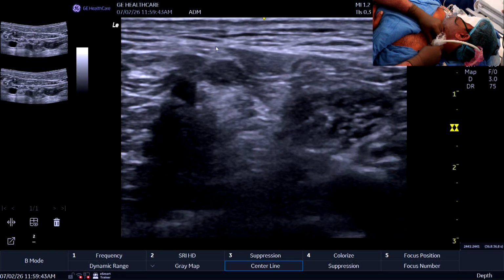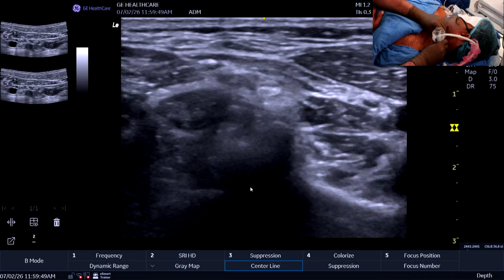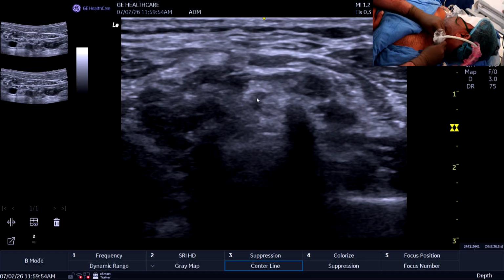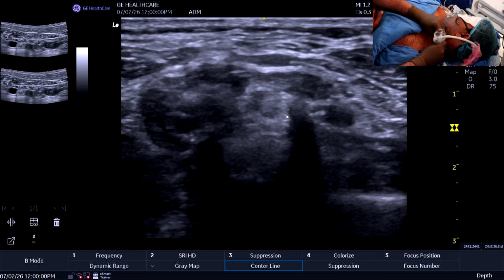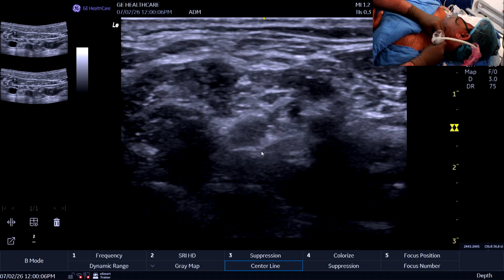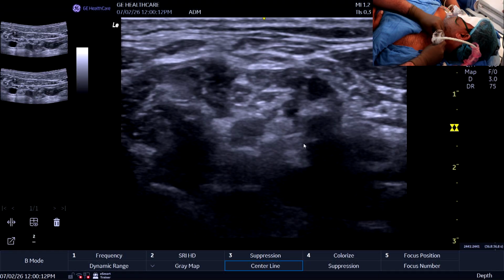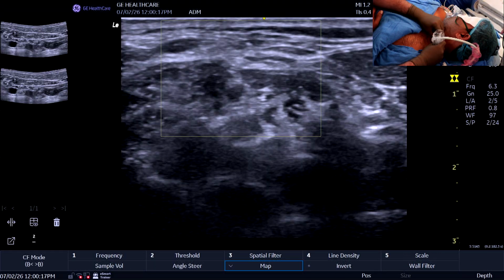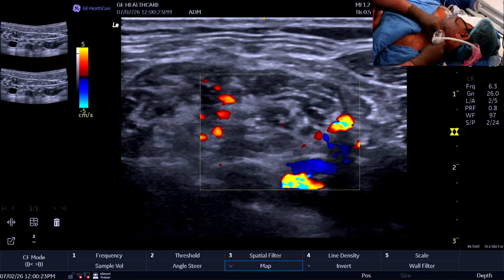And as we come more low down, you can see again we focus on the cervical rami. You will see the C5, then you will see the C6, that's the tubercle, that's the anterior one. Then you have the C7, which will have just the posterior tubercle and no anterior tubercle, and you will have the vertebral artery. If you have color, we can see the vertebral artery, which is close to the C7 rami. So that would be the vertebral artery.